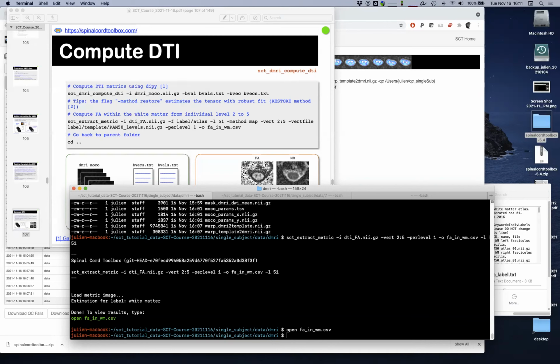That's my message. Pedro? Sorry, is it possible also to save the eigenvalues instead of the measures themselves? Let's see. I vaguely remember someone asking that a few years ago. Did we implement it?